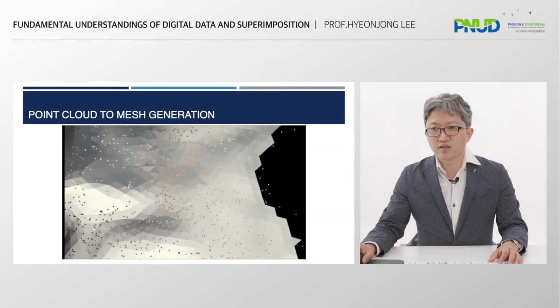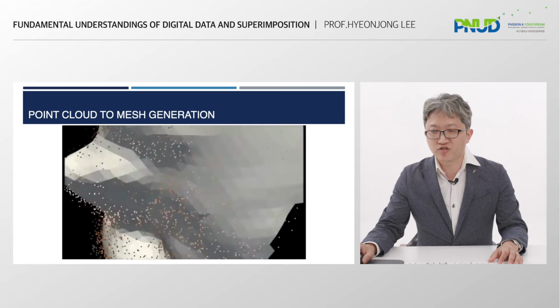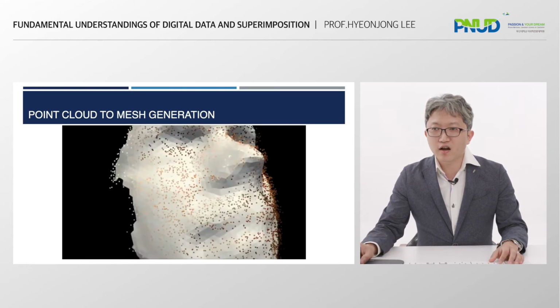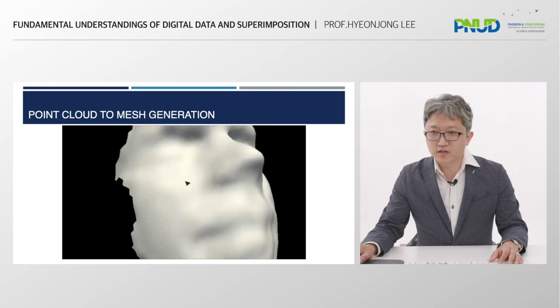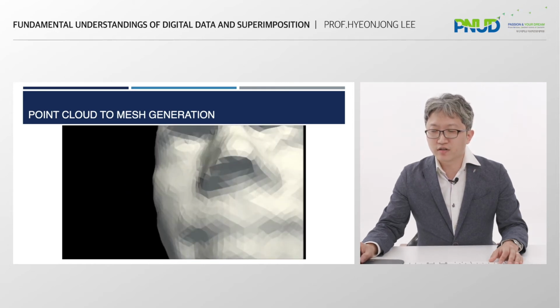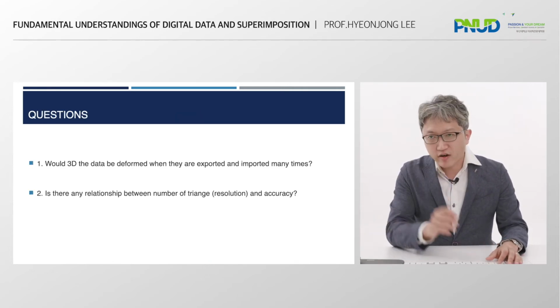And as you can see, one thin 3D surface, the STL file, is just generated. And after that, the color is coded on this surface, smoothed and coded, you will see here. Actually, this is the same as the intraoral scanner.